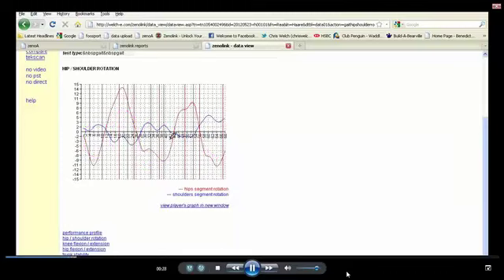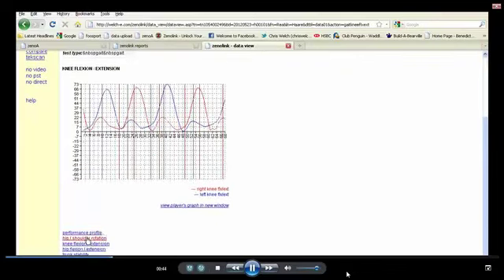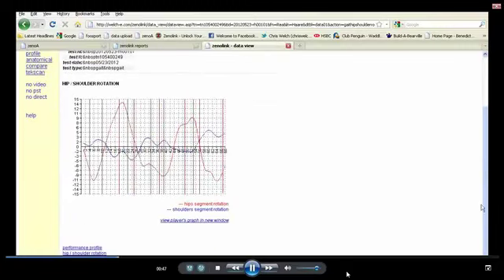We can see here that we do get some counter-torquing, equal, or I should say opposite movement. You'll see that a couple things crop up. First thing that crops up is that the upper torso moves very little relative to the pelvis, and the pelvis is moving about. We typically like to see it somewhere between 8 to 10 degrees. Here we see it moving more like 15. So not huge, but definitely over-rotating a little bit.